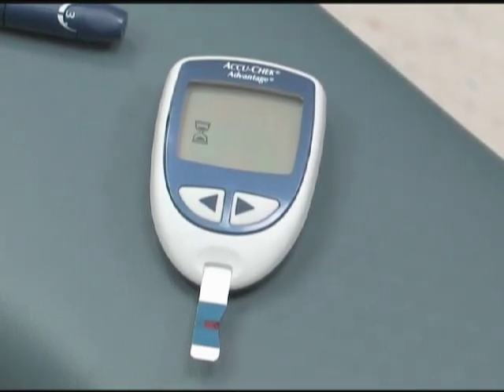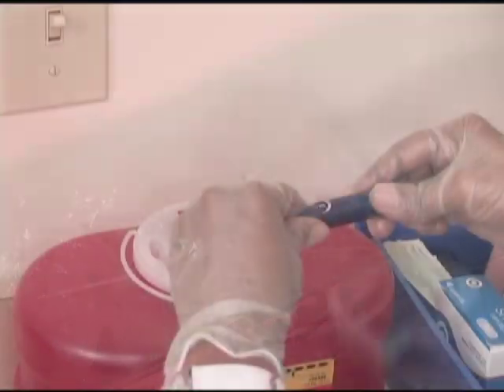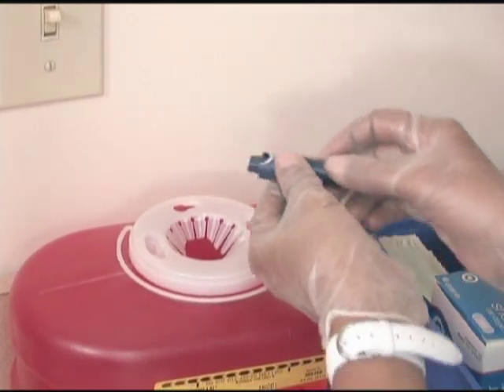The glucose result will appear in the time frame specified by the manufacturer, usually within 30 seconds. Remove the test strip and discard it in a biohazard container. Dispose of the skin puncture device in the sharps container.